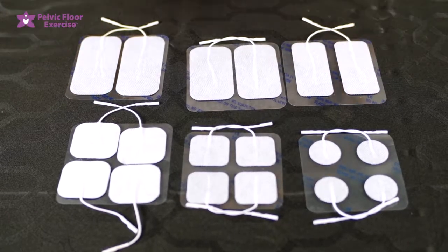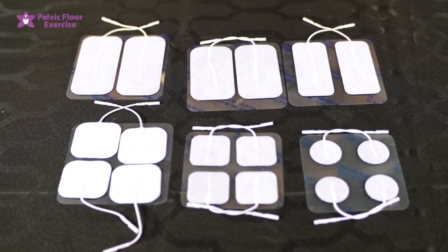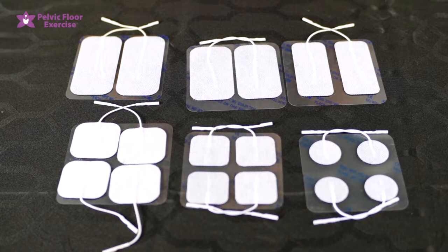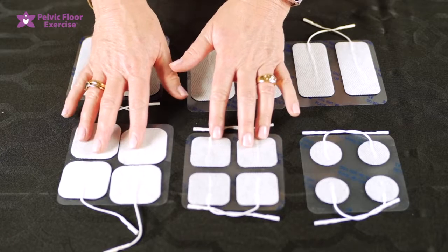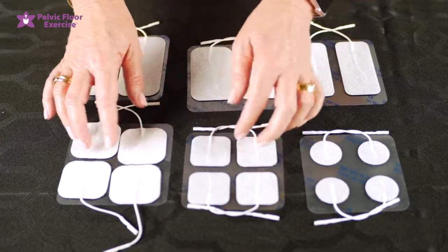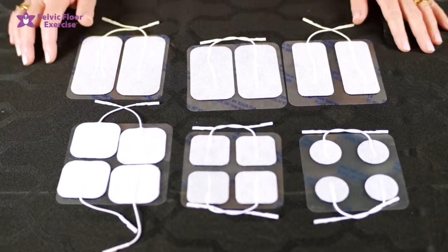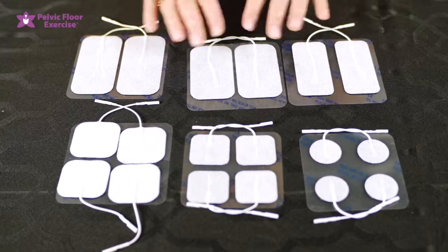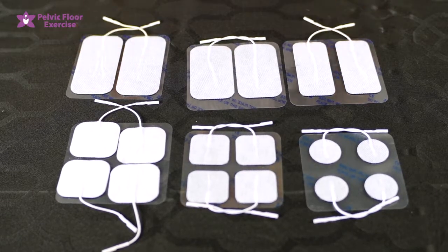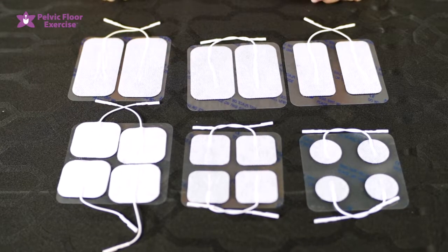The smaller electrodes are generally used on the smaller areas of the body. For example, we'll often use the 30 millimeter ones perianally if we're doing biofeedback for defecation training. The standard size is the 50 by 50, which actually comes with some of the TENS machines. For a smaller person we might drop to the 40 by 40. These can be successfully used around the sacral area and for tibial stimulation for overactive bladder. The larger sizes tend to be used for larger areas like the spine and also come with the obstetric TENS.